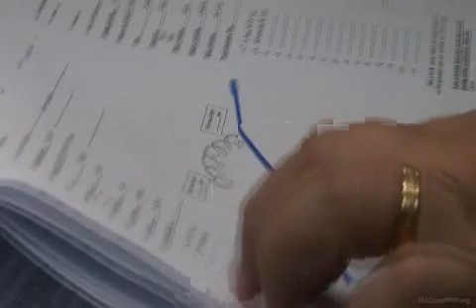Here we have 4 rests on each abutment. So these are stable, there are no rotations. If you can see it on the screen, if these 2 rests are rotating around this fulcrum line, this rest will prevent it, and this rest will prevent it. This is the most stable design.